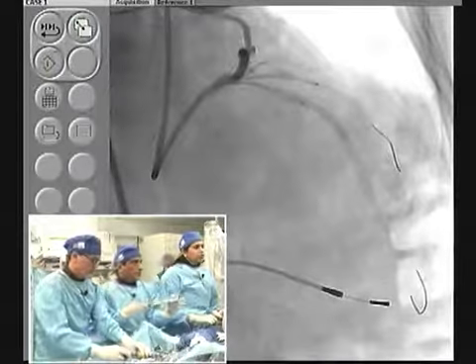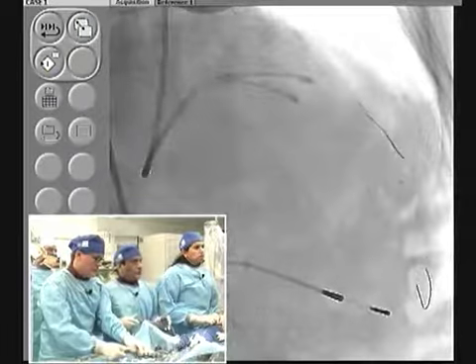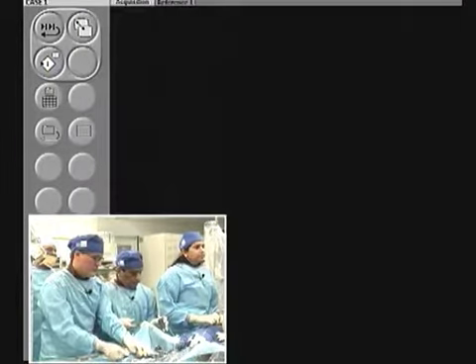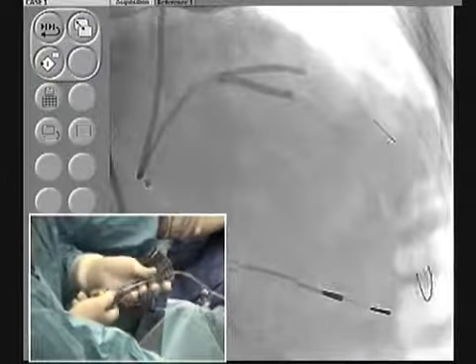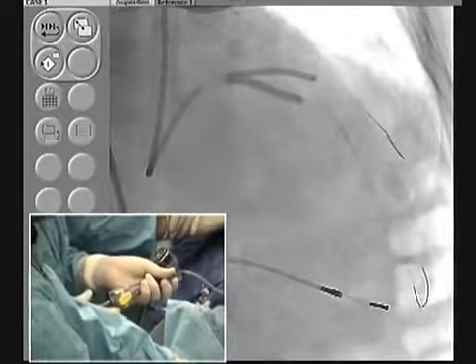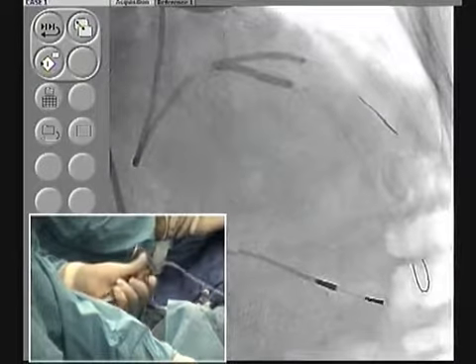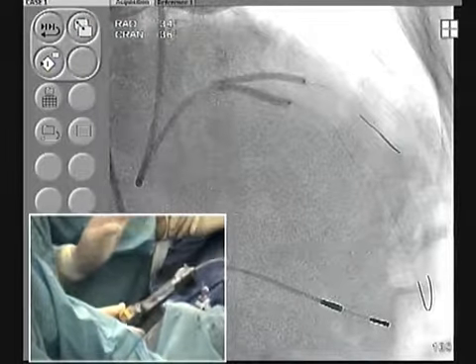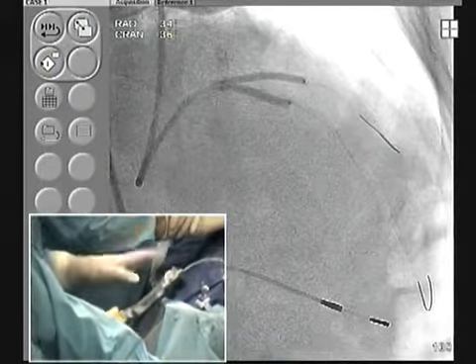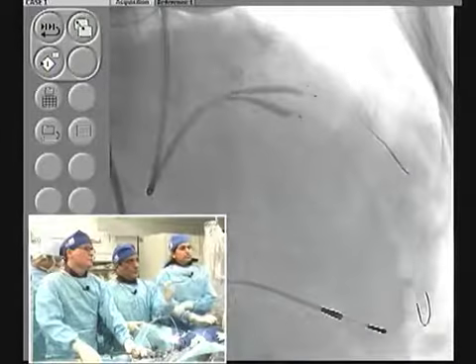The LAD is too much in. Yeah, that's fine. Go up. Okay, we are going up at 10 atmosphere both. For about 15-20 seconds, patient tolerating very well. That's step number 1. Down. Negative. Both simultaneous inflation and then simultaneous deflation. And now you give a little breathing room, let the blood flow.